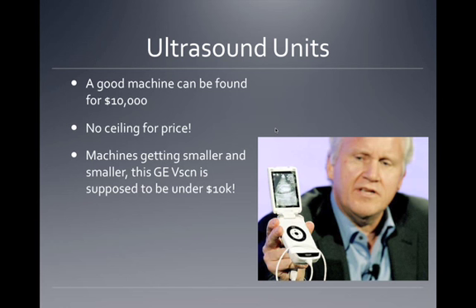We bought them used and got a great price. We bought the two of them for about $30,000, so about $15,000 each. Our older GE machine, we paid closer to $20,000 for, again with two sound heads. But as you look at the three machines, you'll see the image quality has improved dramatically in the 2 or 3 years between buying the GE unit and buying the Sonosite units.